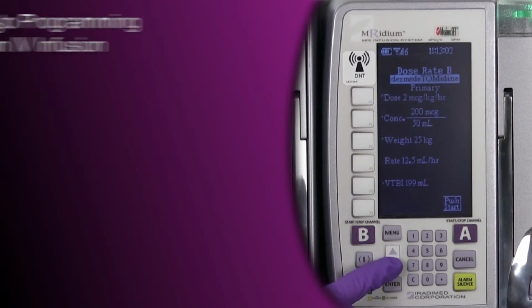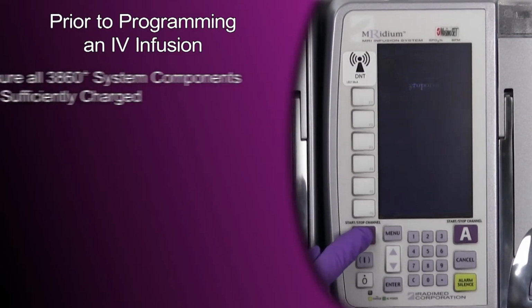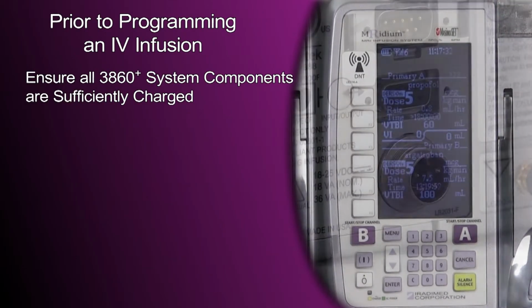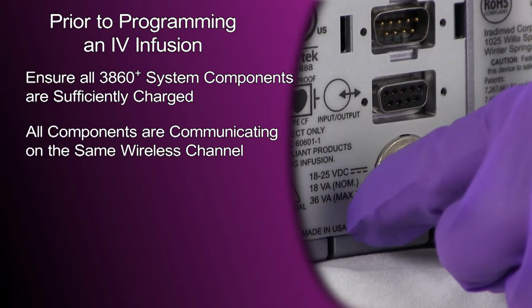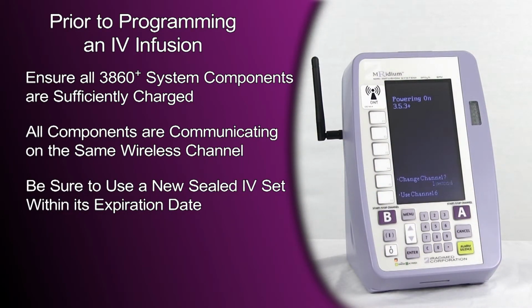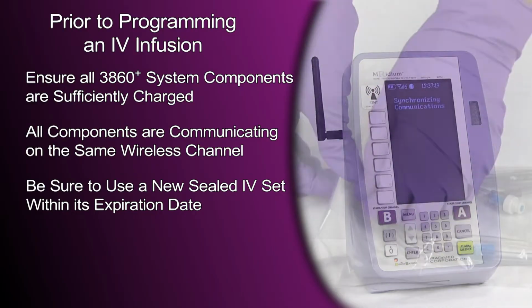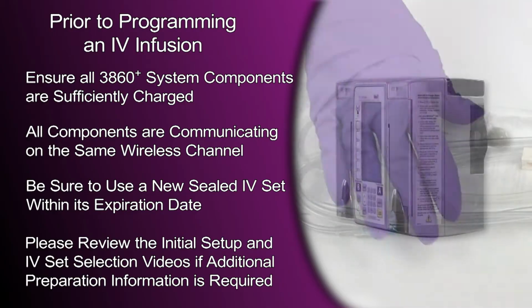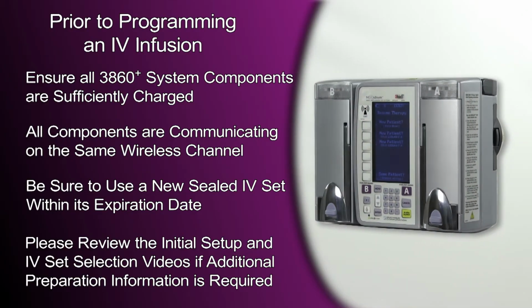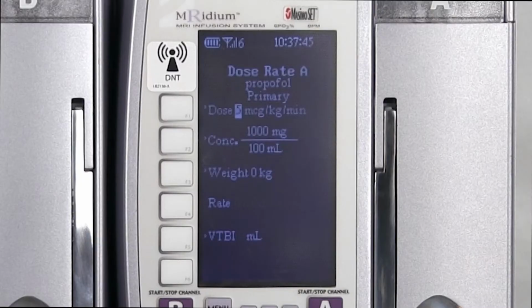Prior to programming an IV infusion, ensure that all 3860 system components are sufficiently charged. All components are communicating on the same wireless channel. Be sure to use a new sealed IV set within its expiration date. Please review the initial setup and IV set selection videos if additional preparation information is required. For training purposes, this video series will use propofol in all demonstrations.